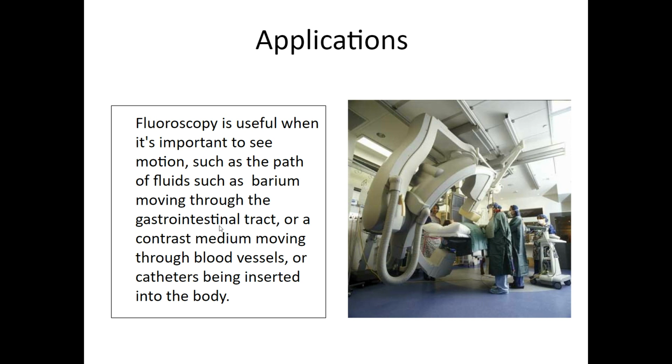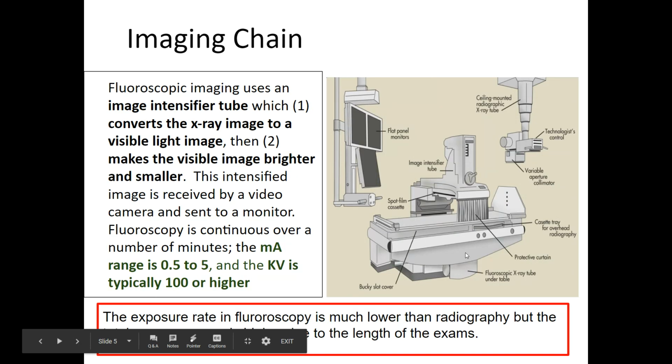So yeah, we're able to see the GI tract. We're able to see angios. They use it when they're putting stents into patients, when they're putting in catheters. If you ever know anyone that's had an angioplasty where they put a balloon to open up a vessel, that's done under fluoroscopic guidance. Pacemakers are done under fluoroscopic guidance. So, I mean, these things are being used, right? Sometimes there's turf wars between the cardiology department and the x-ray department because there's a little bit of a crossover there. Sometimes they'll put an ultrasound probe on a catheter into a patient. So all sorts of interesting things. But yeah, there are cool monitors associated, and there are even studies done where the bigger monitors have actually made a difference in the prognosis to the patient.